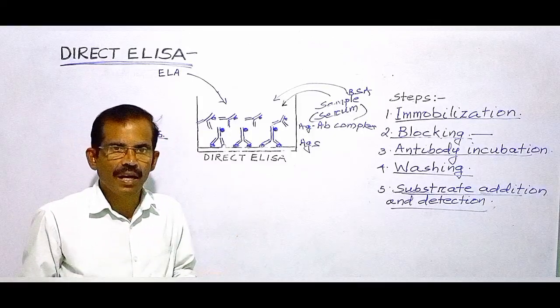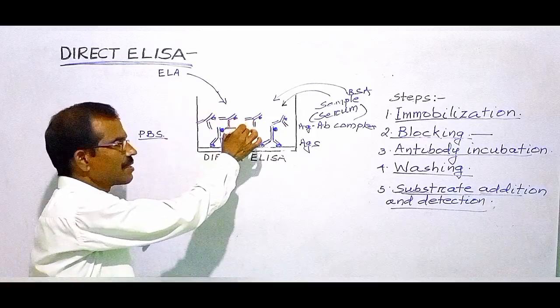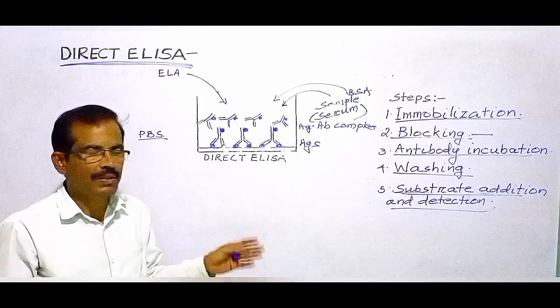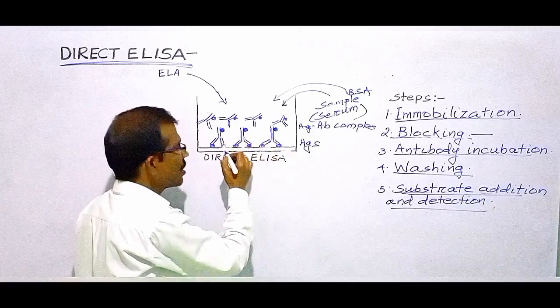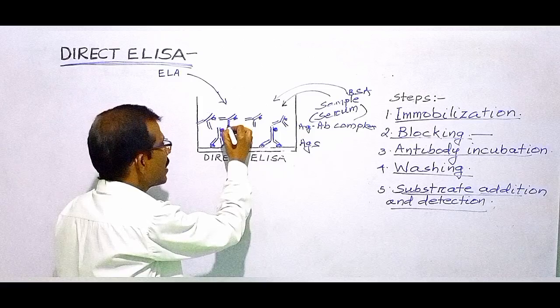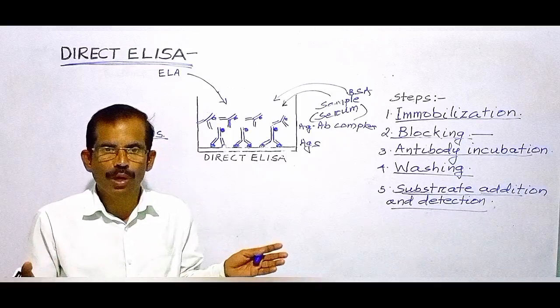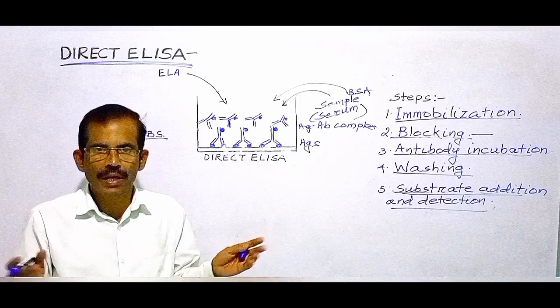The answer is that in this case, when a chromogenic substrate is added to the well, the substrate will be converted into product by the enzymes linked to the bound antibodies as well as by the enzymes linked to the free or unbound antibodies. As a result, more product will be formed and a higher value will be obtained.